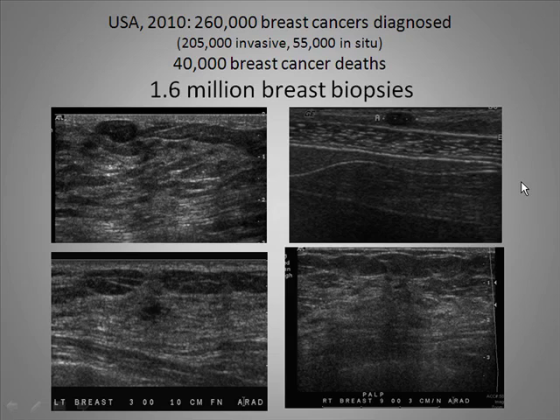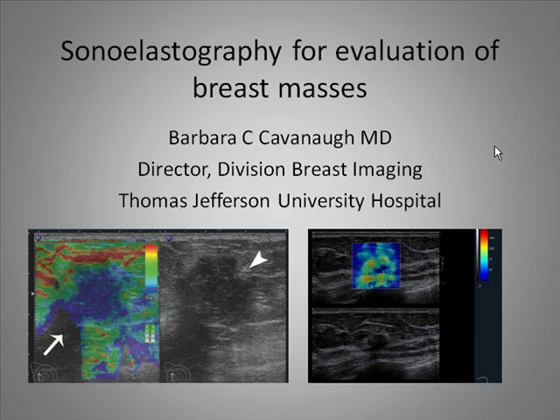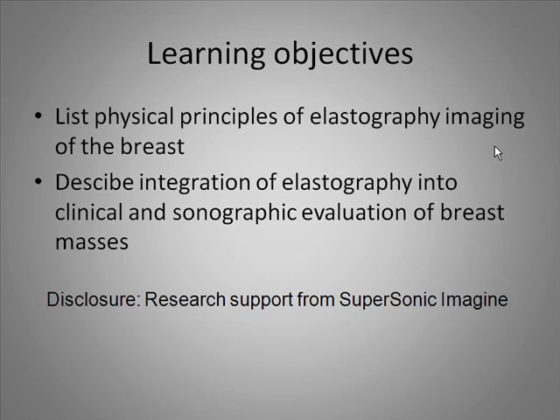Now, these four cases all were malignant. We don't want to miss these. We think that the cost to these patients and to all of us is high if we miss malignancies. At the same time, we really don't want to be doing this many benign biopsies. So today I'm going to be speaking about sonoelastography for the evaluation of breast masses. And my intent is to understand how we can integrate elastography into the clinical and sonographic evaluation of breast masses in an attempt to decrease these benign biopsies but not miss any cancers. I'd like to disclose that I receive research support from Supersonic Imagine.